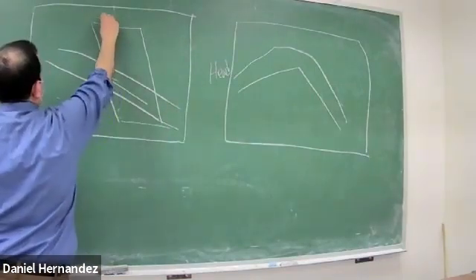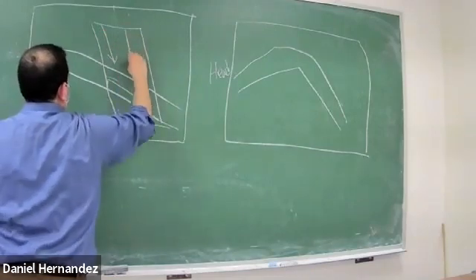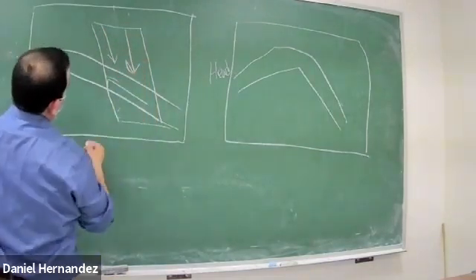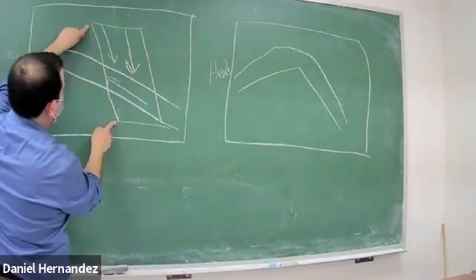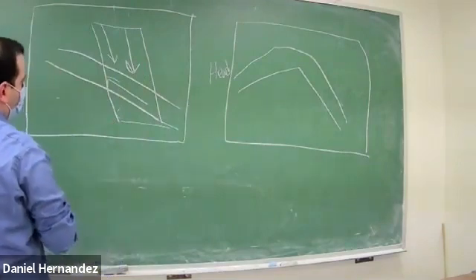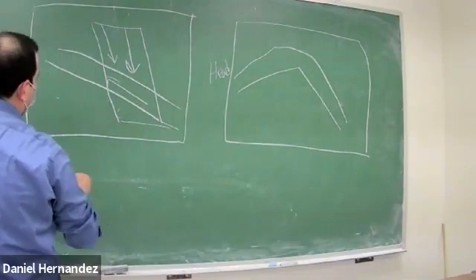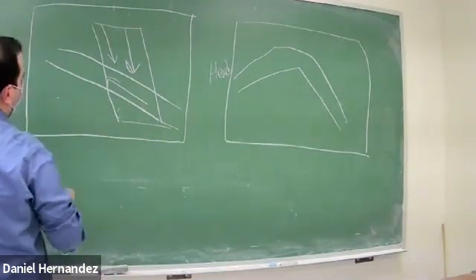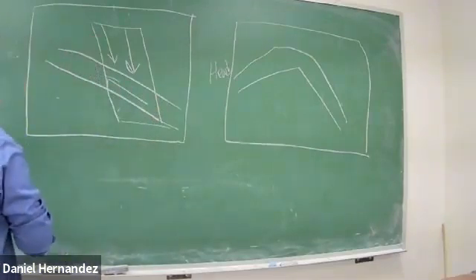So our ultrasound beams are coming out at this angle. The angle of our ultrasound beams is going to be the angle at which we steer our box. So when we're steering our boxes to try and get a good Doppler shift, we want to be almost as parallel to that vessel as we can.